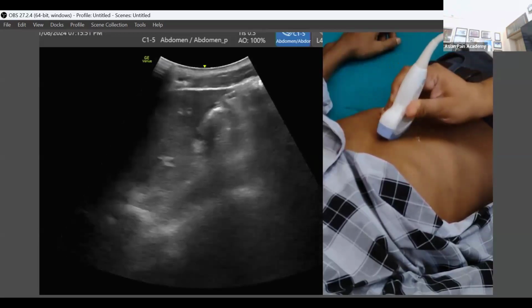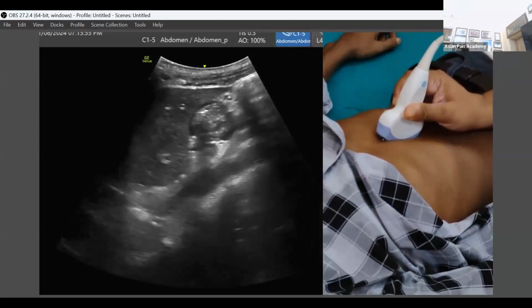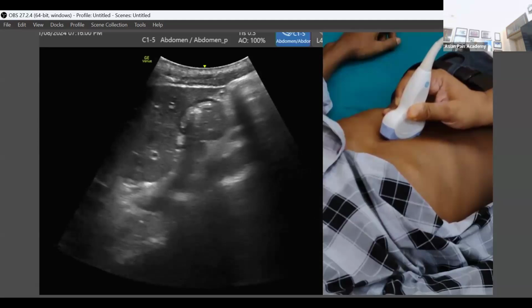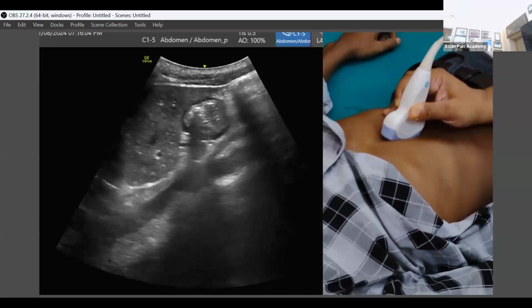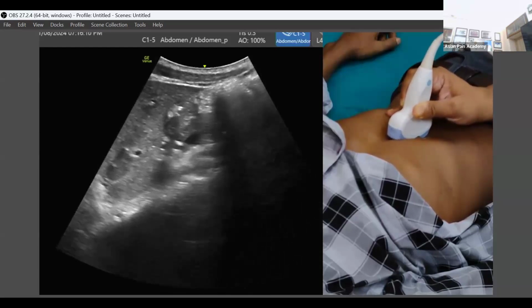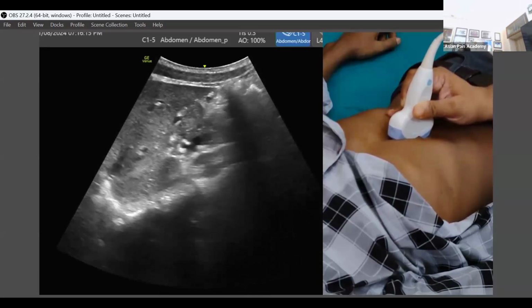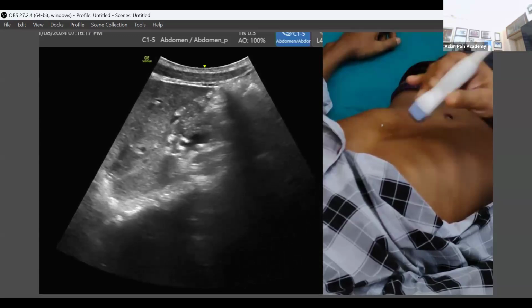Now let us see from the anterior posterior, the longitudinal view. In the long axis view, we can see all the three arteries. See, so this is the, let me check, stop and check. So I told you there are a lot of gas shadows for which it is a little bit difficult to see for this patient. So let me stop and show.